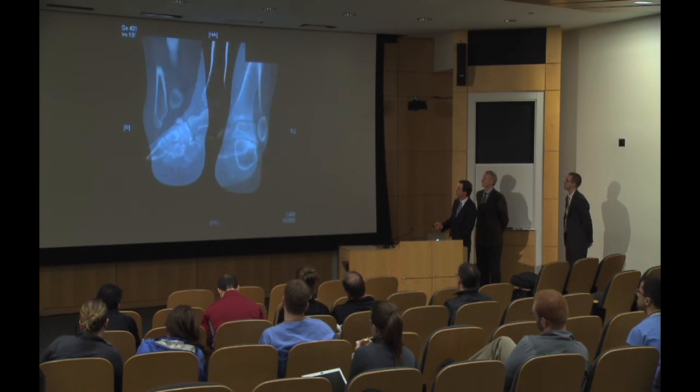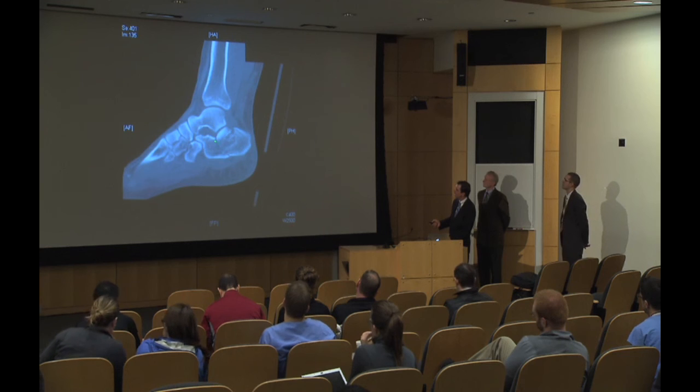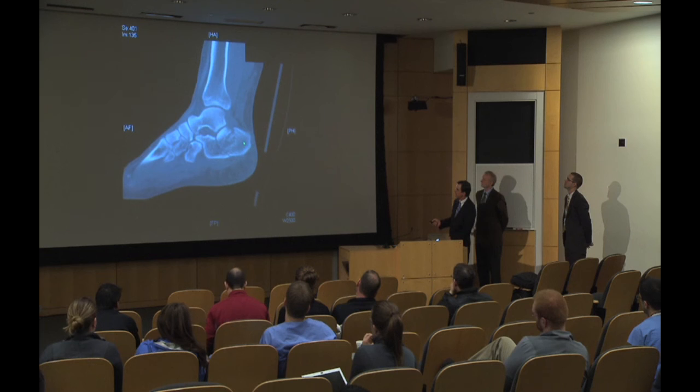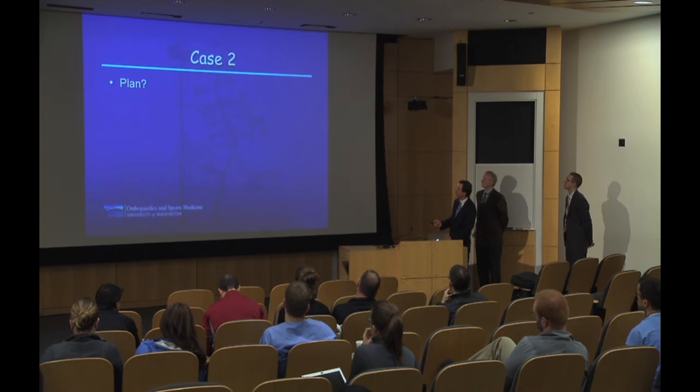This is scrolling through that. And here you see that this depressed area is rotated down slightly. You can see where the articular surface probably should originate and where the tuberosity has to come down. So really her major deformity is actually in the back. I think here, going through that.